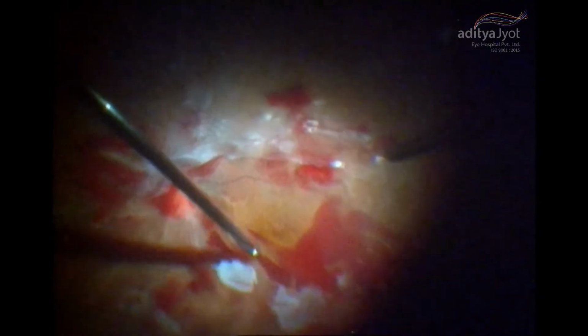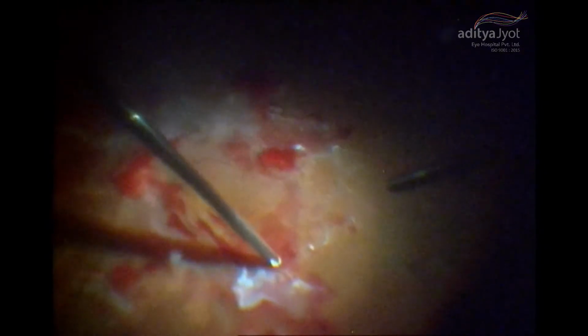And now you see I made islands of fibrovascular tissue, and now cutting one part of the island, and again making 2-3 islands, and then cutting it off, so that I totally remove it. Instead of using forceps and scissors, I'm using the cutter at 10,000 cuts per minute, and then trimming the fibrous proliferation. And you can see mild ooze, and that's expected.